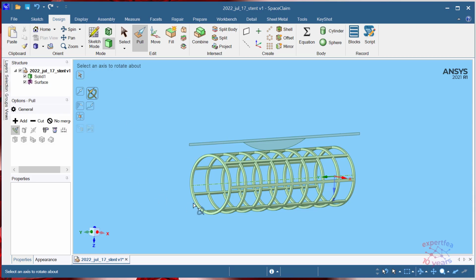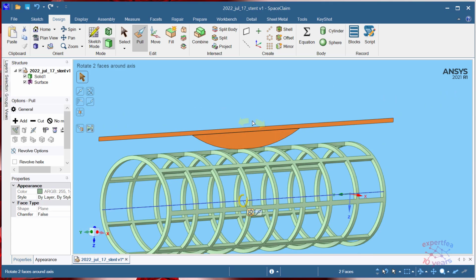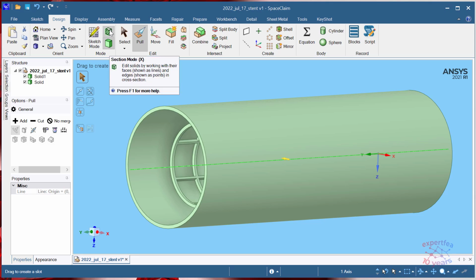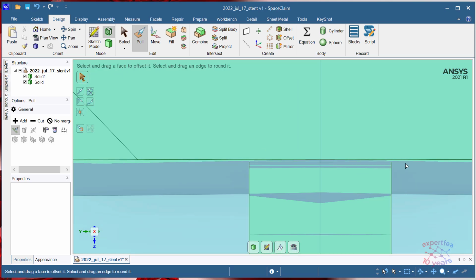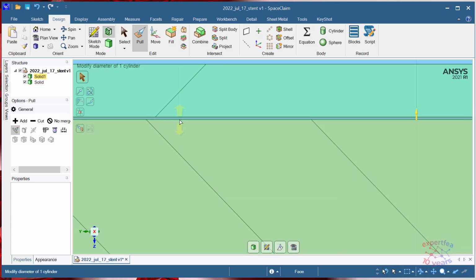It says select an axis to rotate. This is a good axis. Select faces or edges to revolve. This is a good face to revolve, also this one. And we will write from the keyboard 360. If you want to understand what occurred, you select the axis, then go to section mode, and you can see here what occurred. Yes, a small gap here. Ignore these artifacts, graphical errors, and here a much bigger gap.